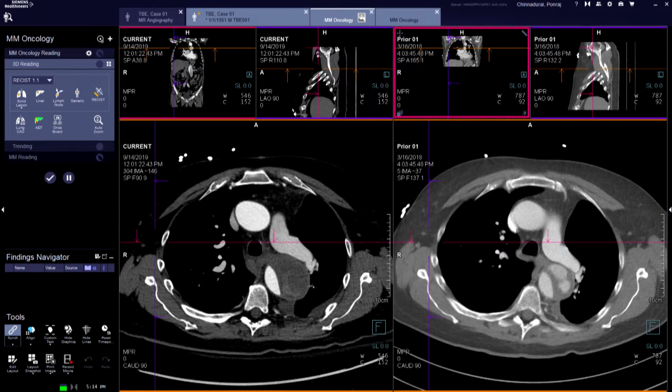So Paraj, can I ask you a question? Frequently we see patients in the middle of their course. We have images that we take at our facility and have to compare them with images that were taken in another facility. Does the software allow you to match them as well if they're done in different machines? That is a very valid question. More often we have patients come with their own CDs from outside scans. So as long as it is a DICOM data set, it doesn't matter which vendor, it doesn't matter which type of scan. As long as it's a DICOM data set, we should be able to load it in 3D and do these kind of comparisons.